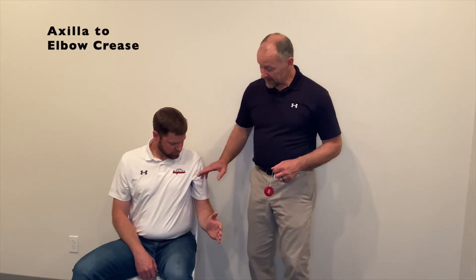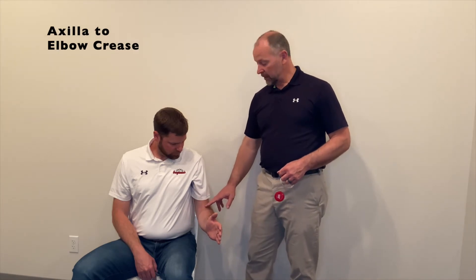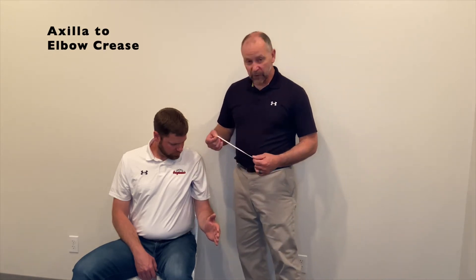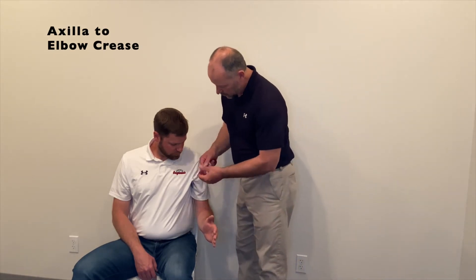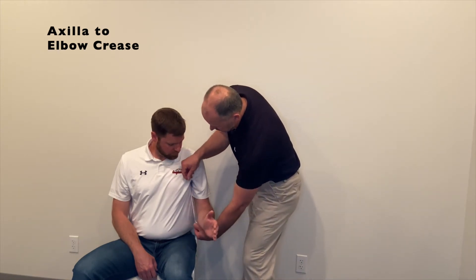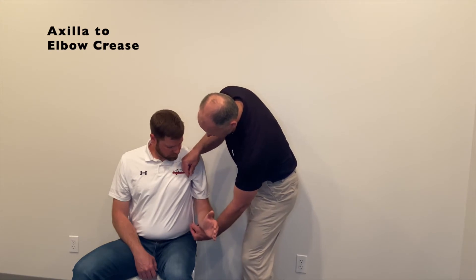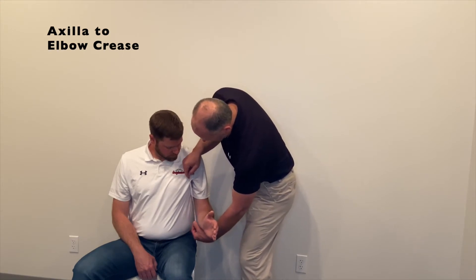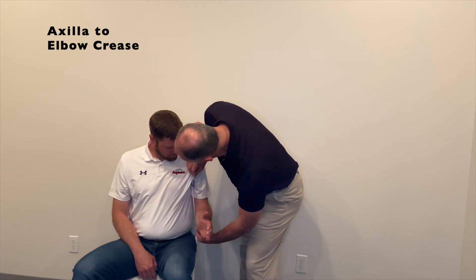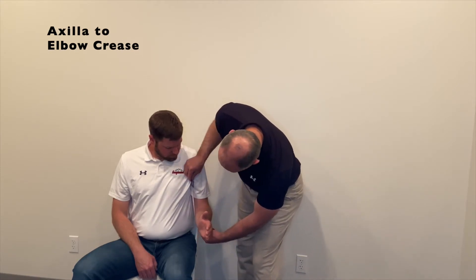Our second upper arm measurement is going to be from the same starting point in the axilla down to the crease of the elbow. The crease of the elbow is where the forearm musculature meets the biceps musculature. Measuring from the top edge of our straight edge down to that crease of the elbow, in this case we get six inches.